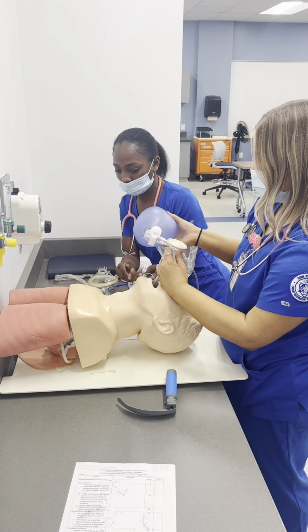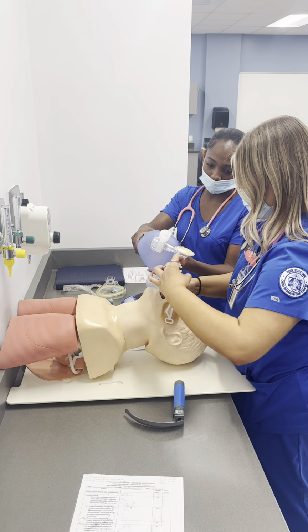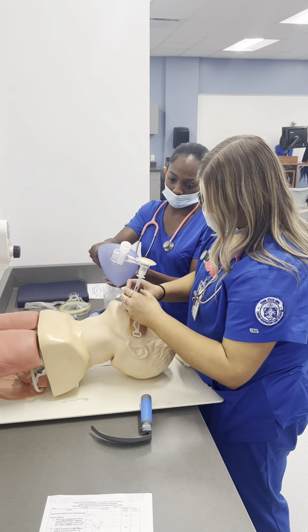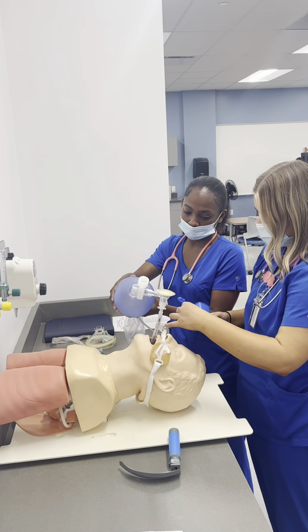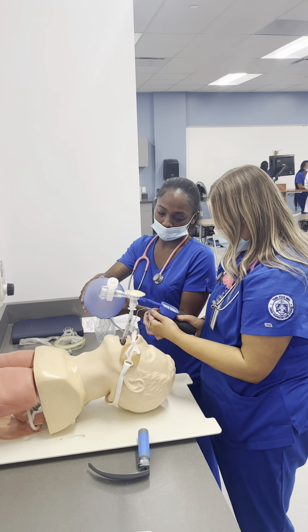Shelby, take over bagging while I test the cuff. Actually, I'm going to secure the tube first and make sure it's not going to go anywhere. Alright, now I'm going to use the pressure manometer to check the cuff to make sure that the pressure isn't too high so it doesn't cause any tracheal damage, and make sure it is between 20 and 30 centimeters of water pressure.